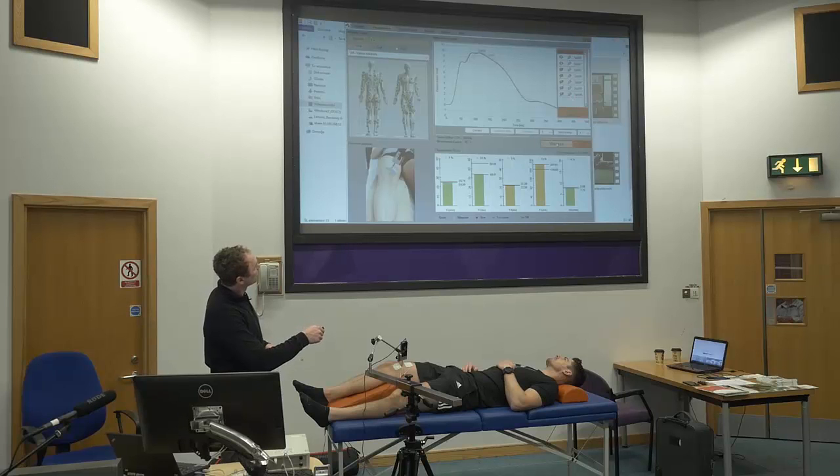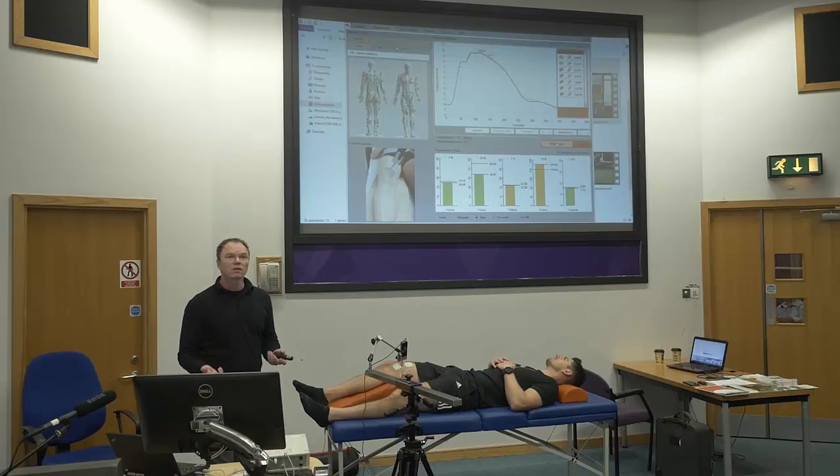The feedback shows the muscle is 4% faster than the average value — his value is 24.6 ms, the average is 25.7 or 25.8 ms. Displacement is just about optimal, only 4% different from the average. We have a lot of green color, especially on the first and last parameters. I would consider this quite a nice response — that's one muscle, the protocol for measuring one particular muscle.